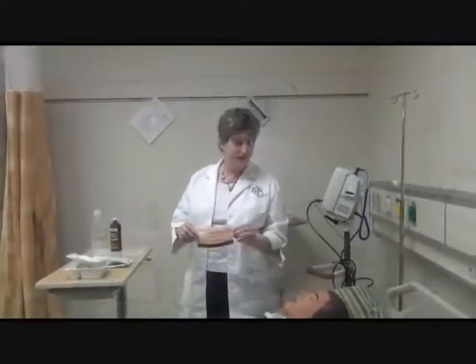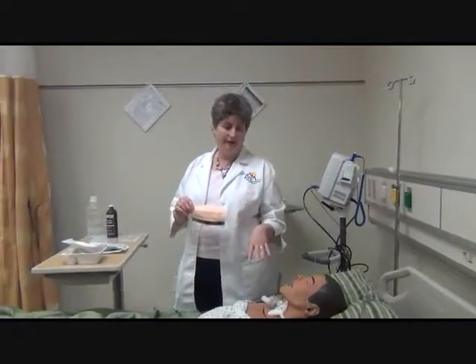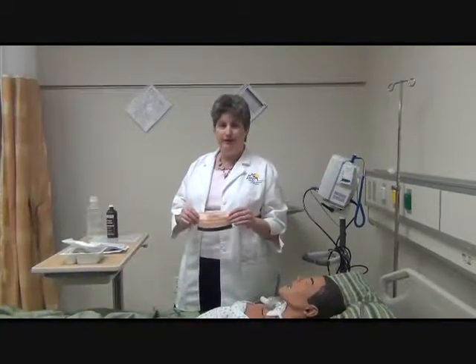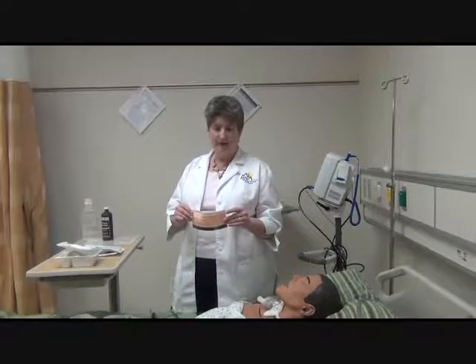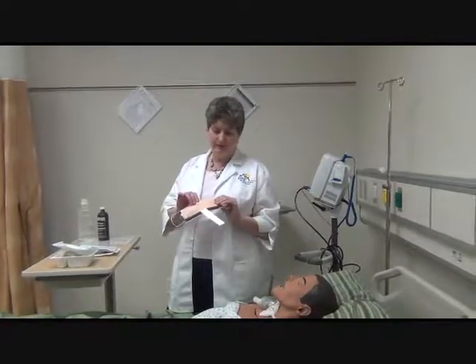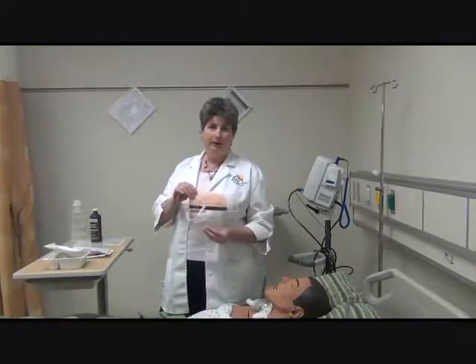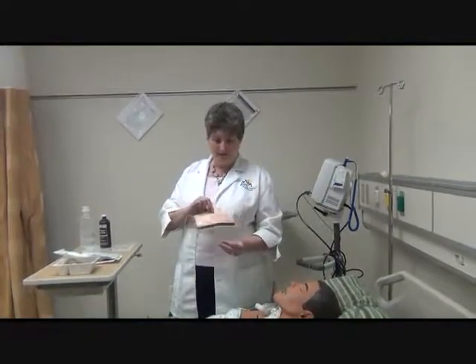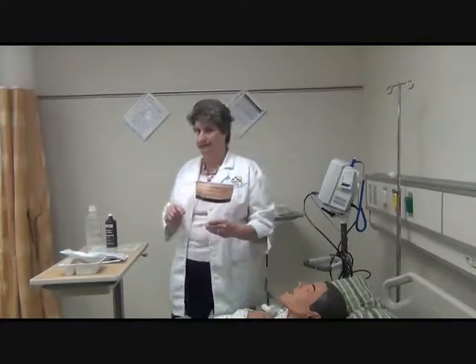I just want to remind you that with this procedure, there are a lot of potentials for droplet contamination. So you want to always make sure that, if you wear prescription glasses, you're wearing a pair of goggles. Also, it's a nice idea to have on a mask with face shield. I won't be putting that on for filming purposes, only because it's going to be hard for you to hear me, and it muffles the sound. But again, you want to do that as a self-protection mechanism.